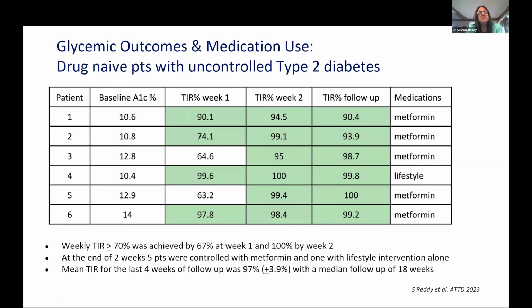This means that if you have somebody in your clinic who you think you want to start on a CGM and you're going to see them in 2 or 3 days, or you could monitor them in some way, it would be fine to do that. Otherwise, I would not recommend doing it because it's not standard of care. But I show this to you to show you how much behavior change you can see with CGM.